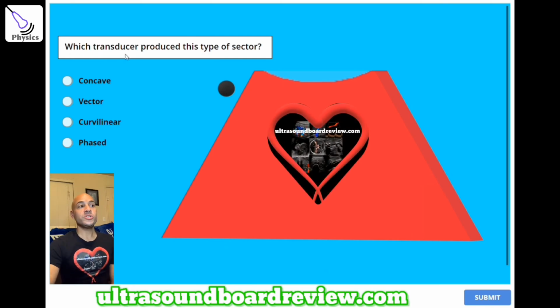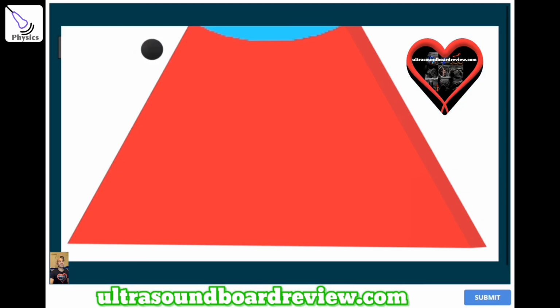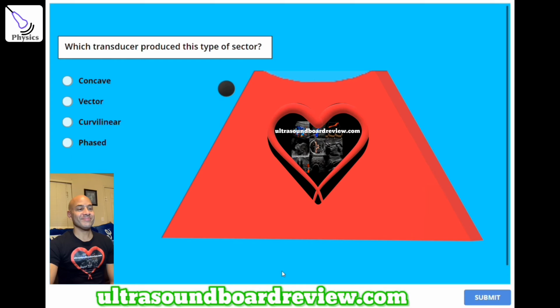Question 23. Which transducer produced this type of sector? A, concave, B, vector, C, curvilinear, or D, phased? The answer is C, curvilinear, hence the blunted sector.